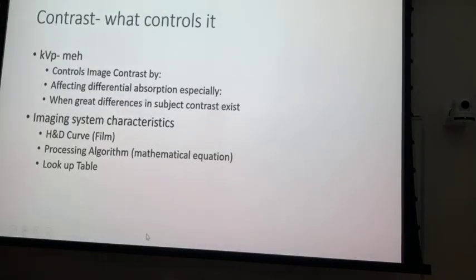So contrast, what controls it? kVp, no, not really. You've got to know that's the technical factor we use, but it's really controlled by the computer algorithm. But the kVp still does affect the differential absorption inside of the patient, and without the kVp and without that differential absorption, we wouldn't have an image at all.